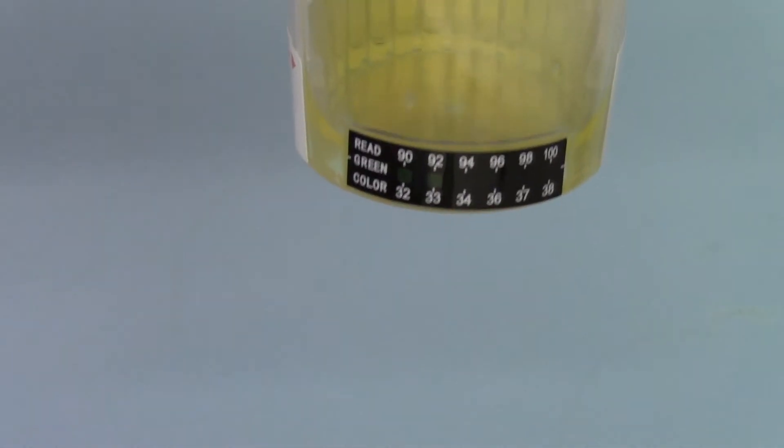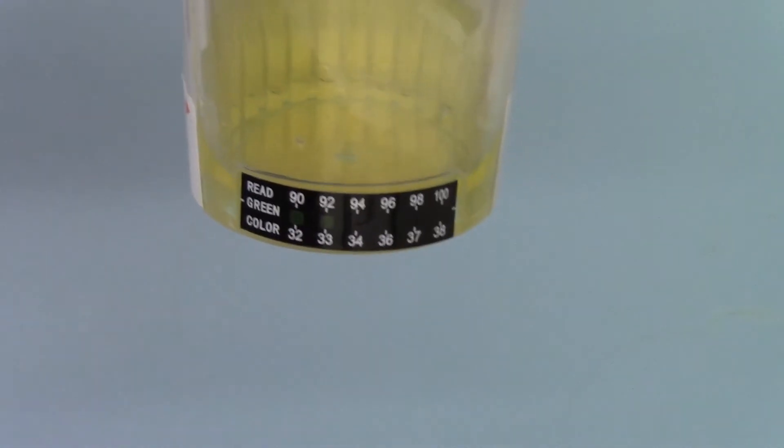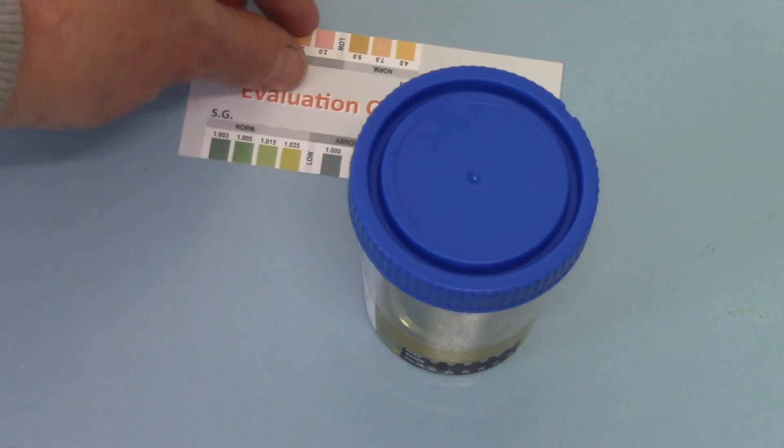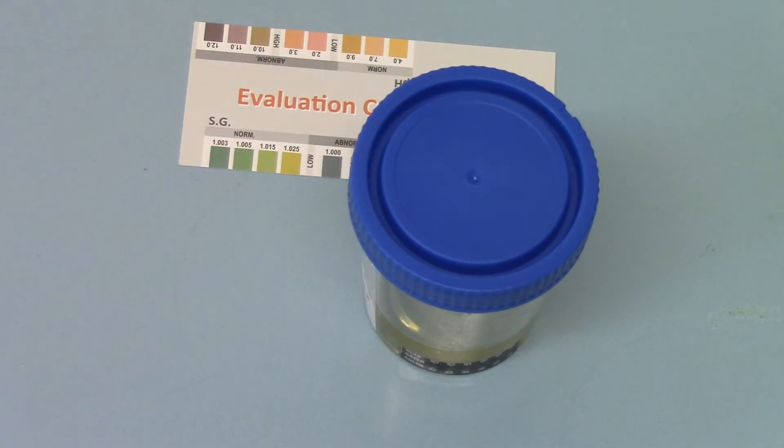That combined with the temperature test is a good level of checks to make sure that the sample you're screening and interpreting the results on is a fresh, undiluted urine sample from the donor. It's just reassurance of the validity of the test results for the drug screens that you've run.